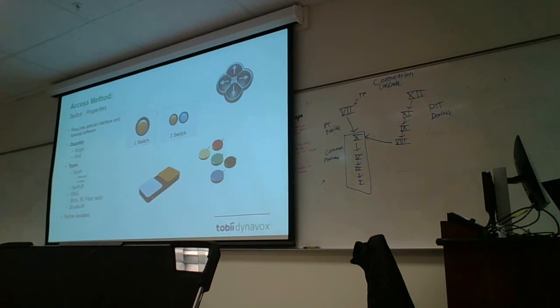In terms of switches, that's something, again, that we discussed during the evaluation process. I have some switches that I bring with me, and we talk about the most appropriate access methods. In the past, I had a student that was using one of the older i series devices, not with eye gaze, but she had two switches set up. She had a wheelchair that had a tray, and we put the switches upside down under her tray, and she was using her knees to activate them, and she was using step switch scanning, and it was amazing. I think she could do it quicker than I could touch the screen. It's really nice to see.